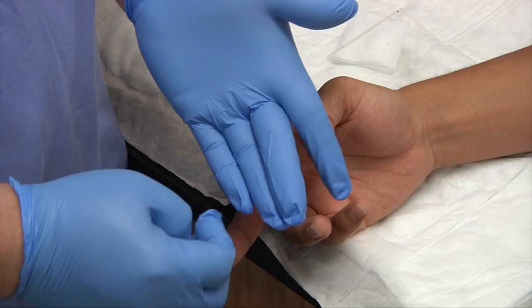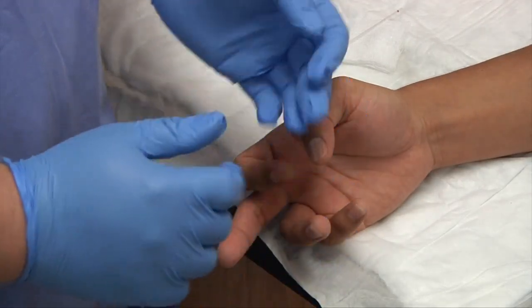The same thing applies if we're doing a heel stick on a baby — we'll go lateral, not medial.